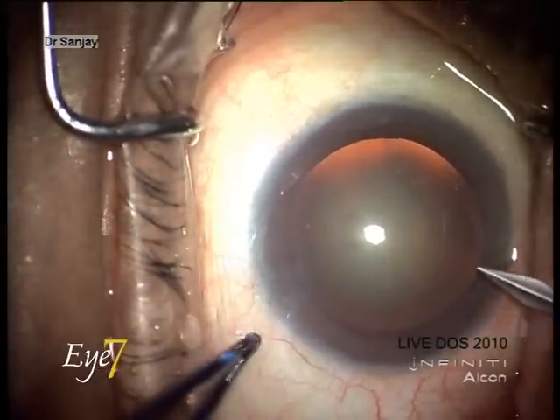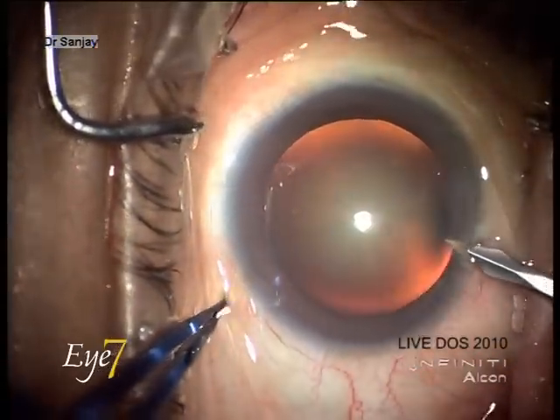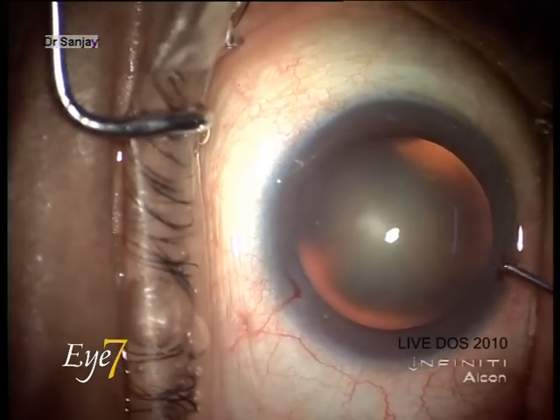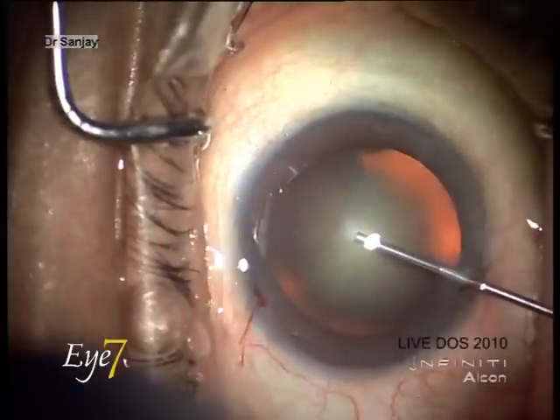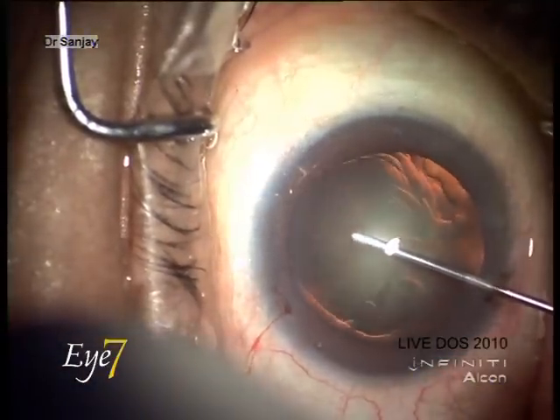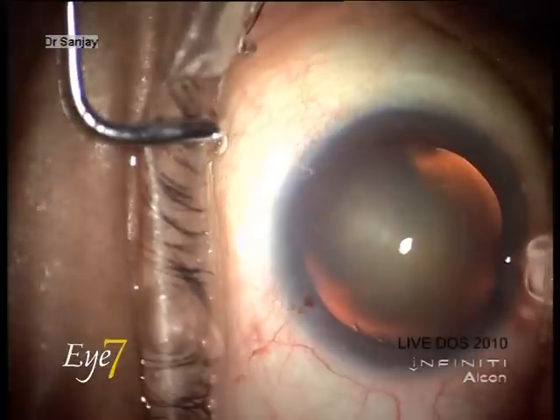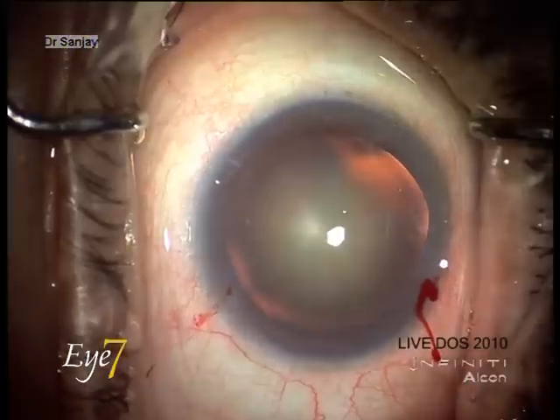The ReSTOR multifocal intraocular lens has a plus three add and is an aspheric lens, which gives better contrast and better distance, intermediary, and near vision.